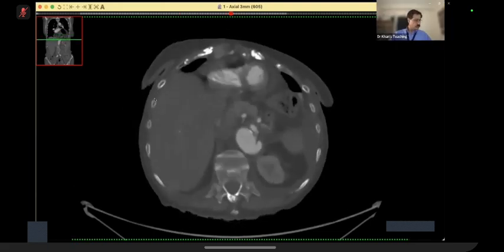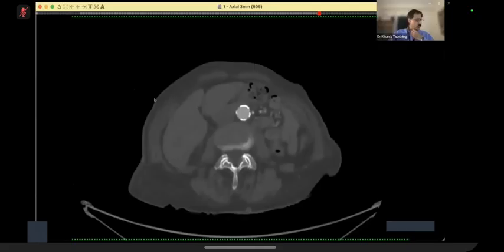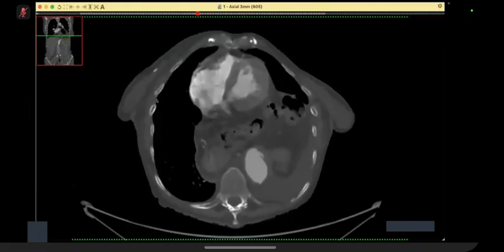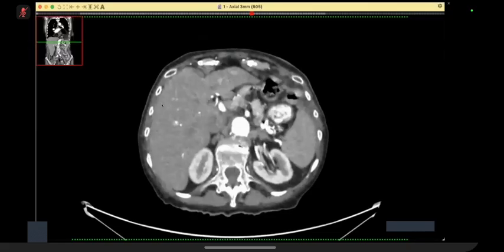Now, candidate 2. Yes, sir. 89-year-old female, syncope, loss of consciousness, 4 minutes, 2 episodes, stabbing chest pain. They have asked for an aorta study. Over to you. Yes. So can I ask for a remote?